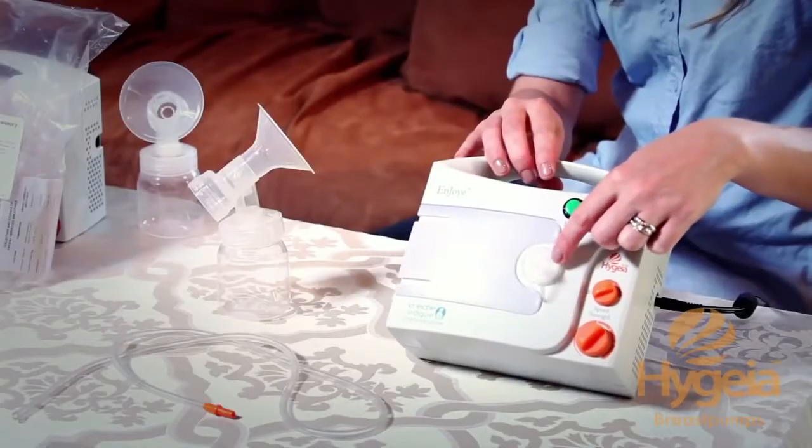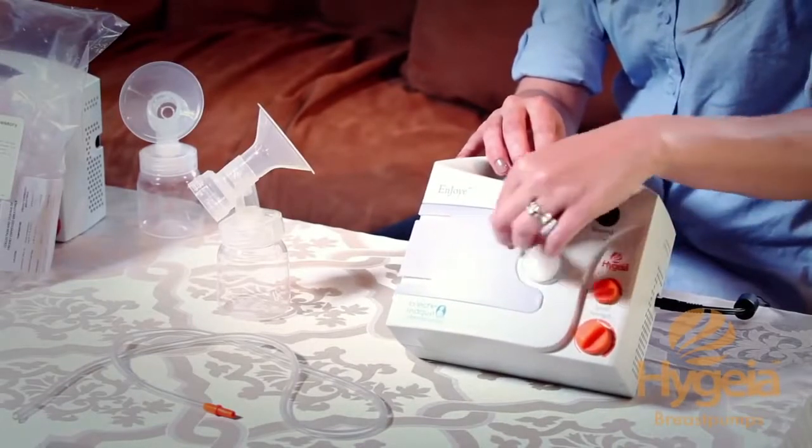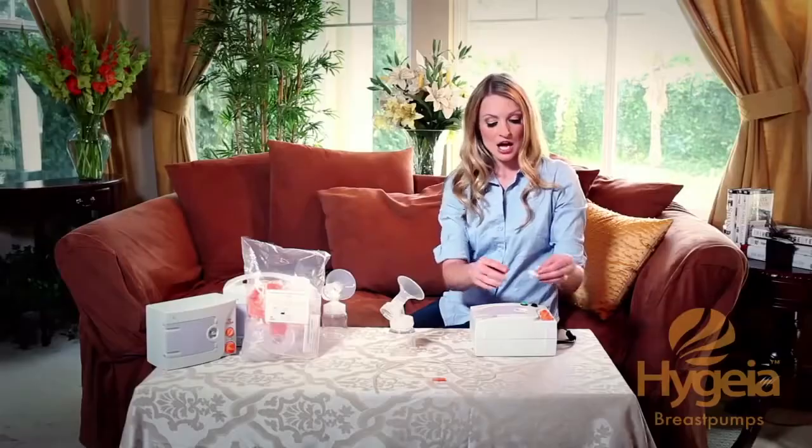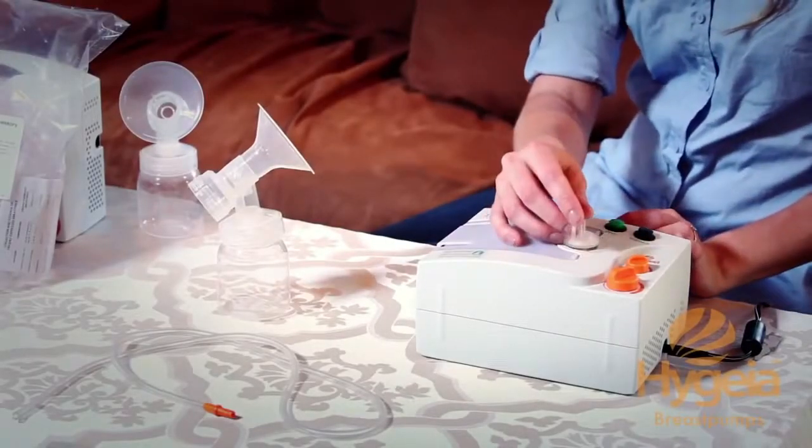Your pump should have a filter attached to it when you take it out of the box. This is a bacteriostatic filter that twists on and off like so. You'll notice that I'm barely using any pressure and I'm treating this very gently.